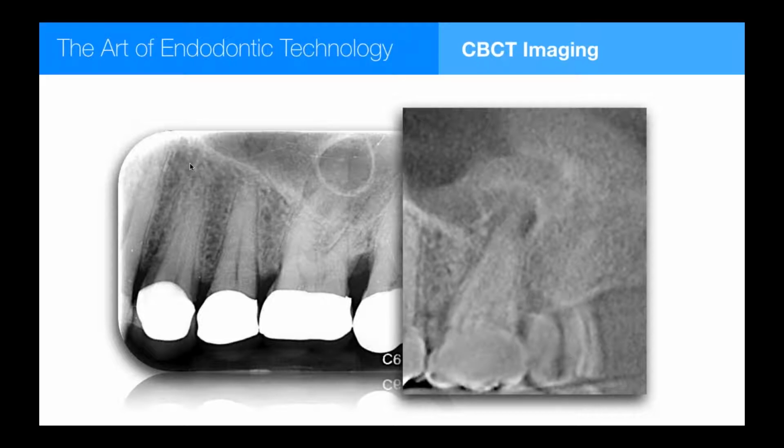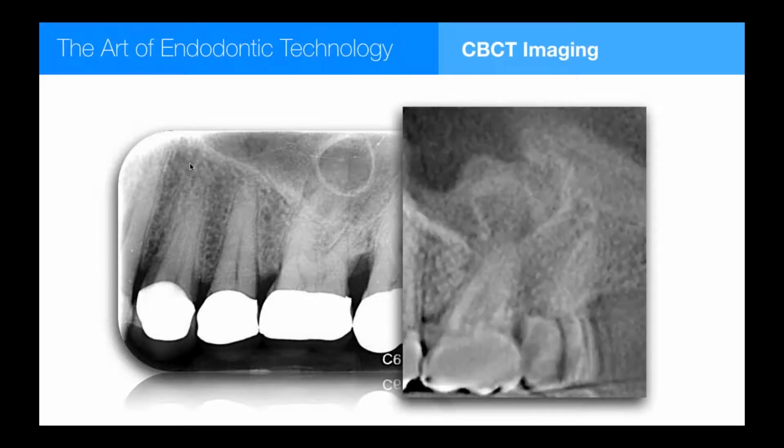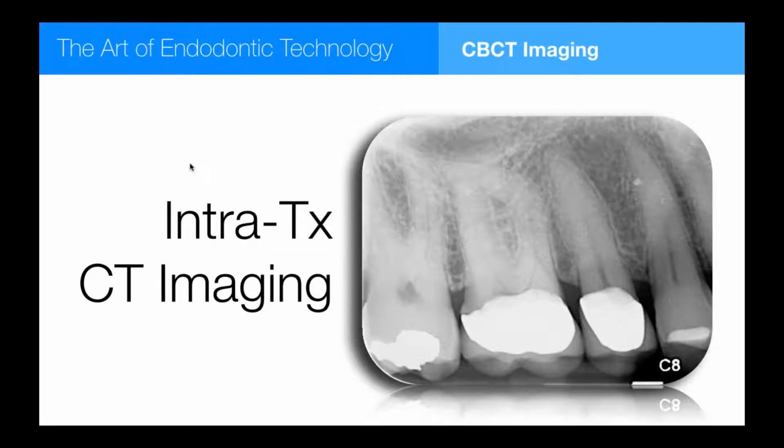And once you start doing CBCT imaging, you realize that we never realized that you have to have bone around a root end to have a radiolucency. And when they're in sinuses or outside the cortical plate, it requires volumetric imaging to tell what's really going on. There, it's an obvious lesion, but when we look at the pre-op on the left, looking at the palatal root tip through the halo of the lesion, I can read a PDL there. So we'll get fooled all the time, and in this case, we know exactly that it's basically a cystic sac encapsulating the infection coming out of that palatal canal.